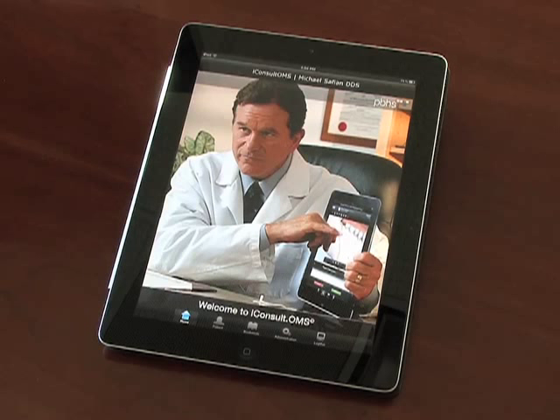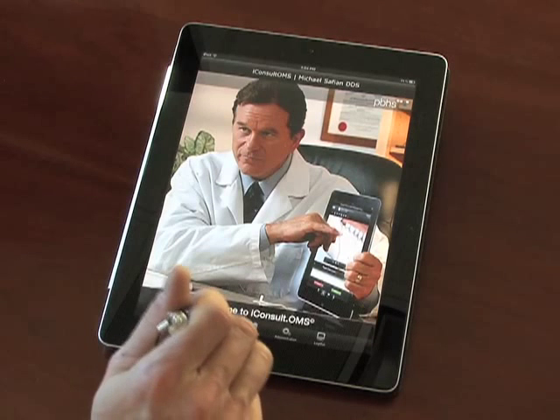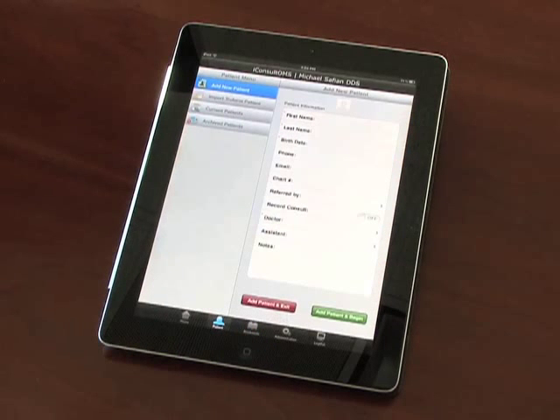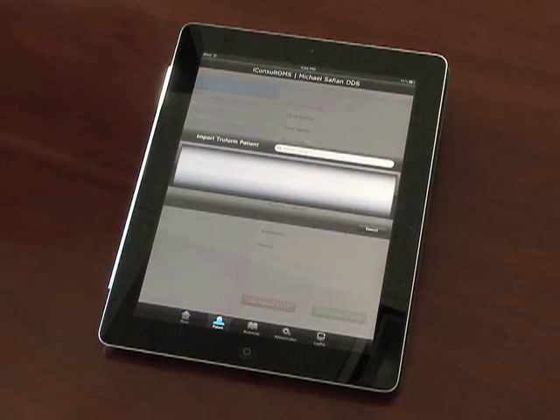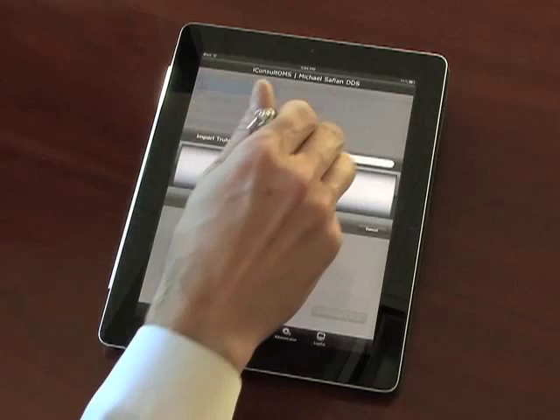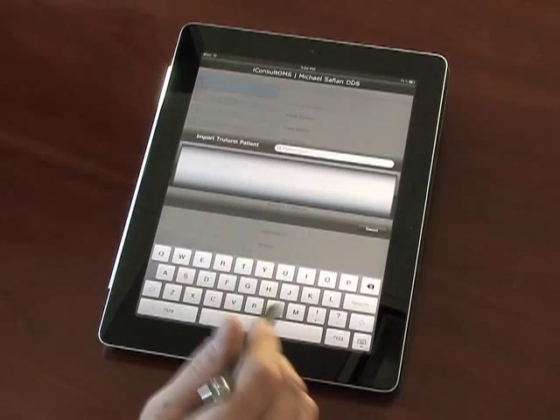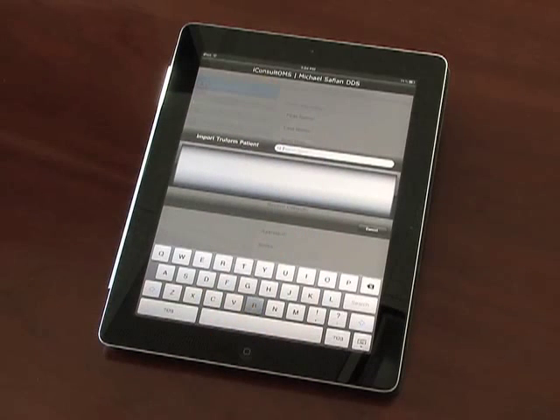After launching the application, you will be taken to the home screen. To add a patient, enter Patient Mode. You can add a patient manually by filling out the chart on the right, or you can import a patient's data from your TrueForm database.